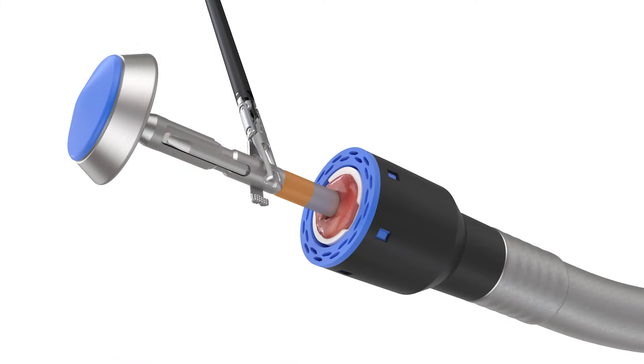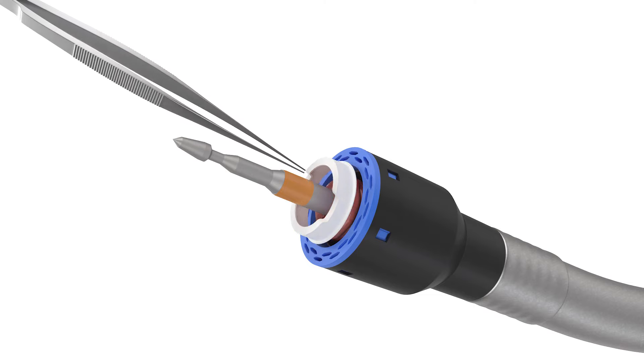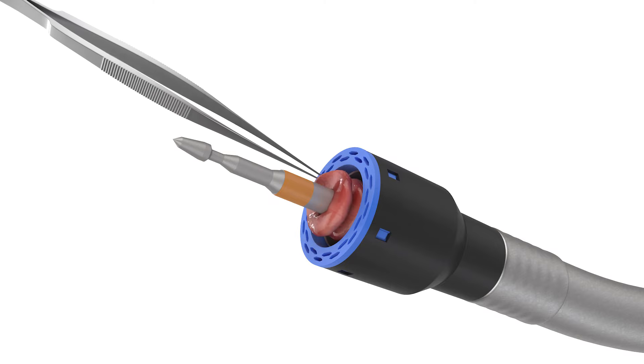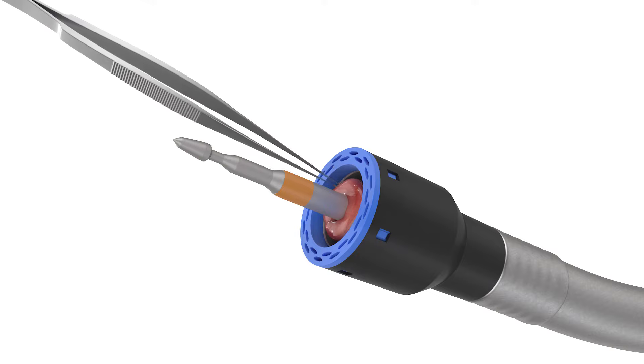Remove the anvil, washer, and doughnuts from within the circular knife. Examine the integrity of the doughnuts, which should be intact and include all tissue layers. Carefully check the anastomosis for leakage and by your own technique make appropriate repairs.